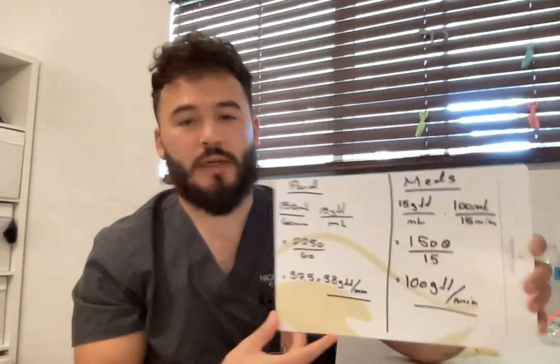I'll be doing the fluid and medication video. So first and foremost, we want to introduce ourselves to the patient. Our patient is coming in to get fluid and medication via amoxicillin. So before I even talk to the patient, I want to make sure that I have my calculations correct.